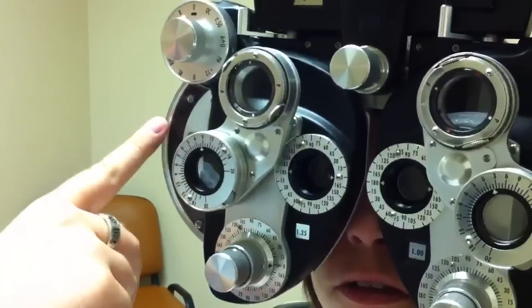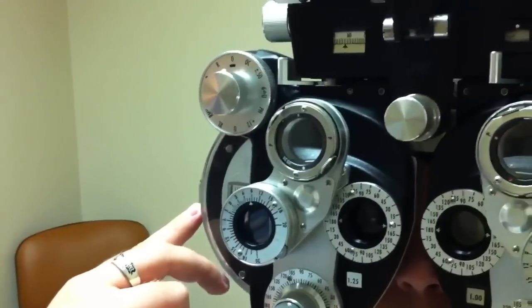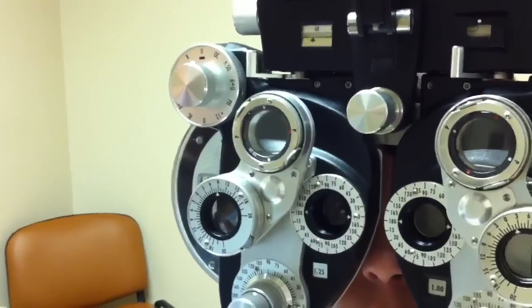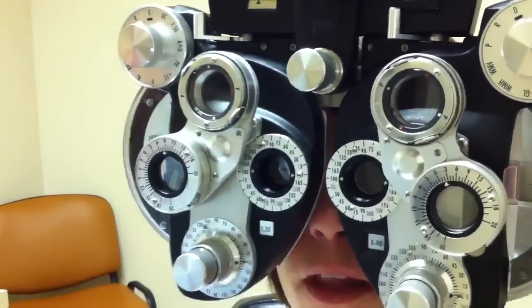Then I recheck the sphere one more time. One or two? One. Still see the bottom pretty clear? E-V-O-T-Z. Good. And that's right about the same.